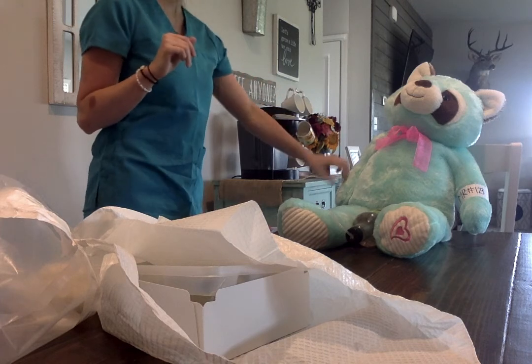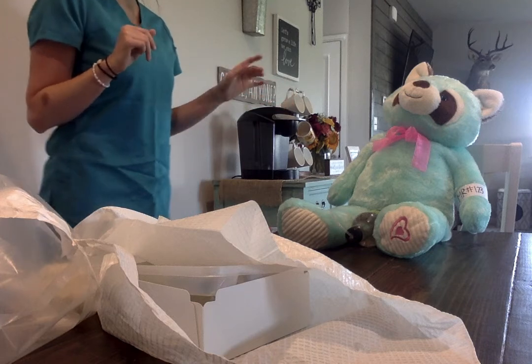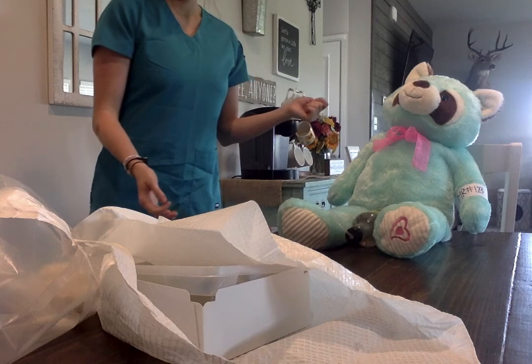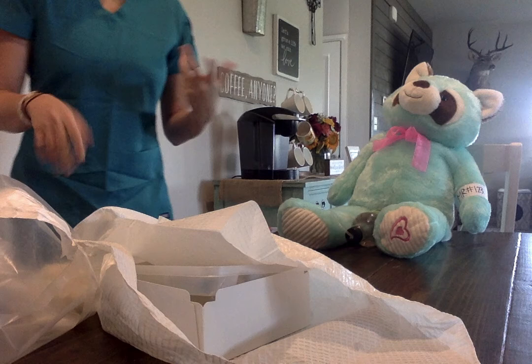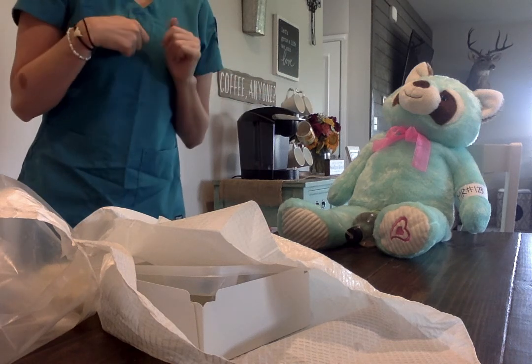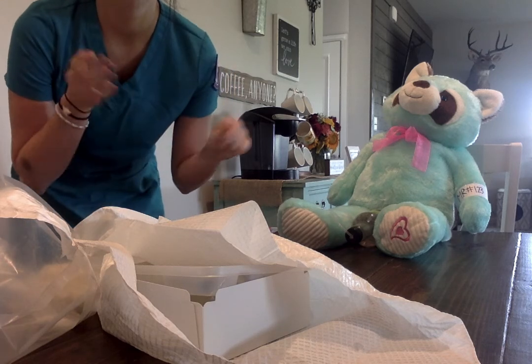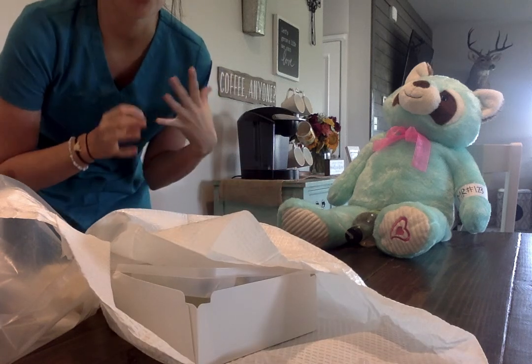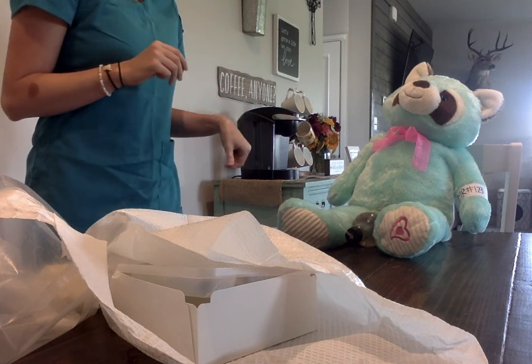And here's your call light. I'm going to put it in your hand. I want you to call me. Press that button if you need anything at all. I'm going to lower the bed, raise the bed rails, and we're done. Oh, and I'm going to foam out, exit, and I'm going to document the size of the catheter, the color and clarity of the urine, and then I'm going to document his response as well.